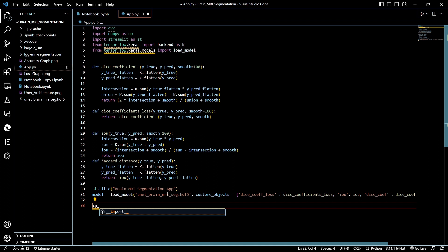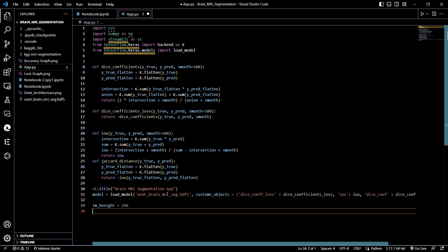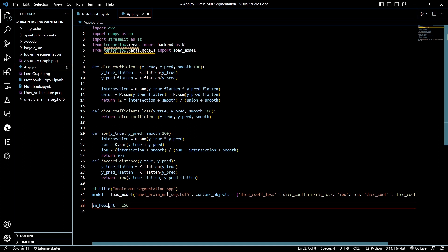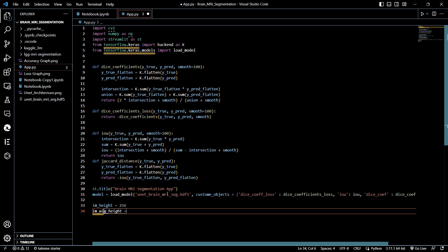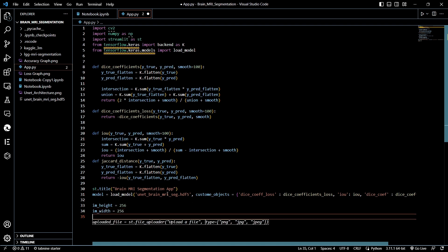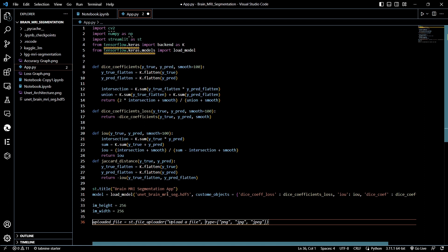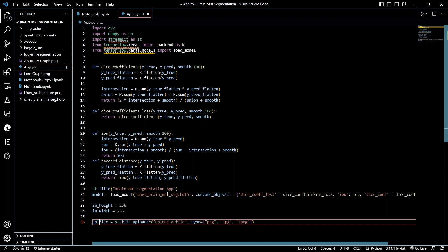Now let's set image_height to 256, as we discussed earlier, and image_width also to 256. Next, we define the uploaded file variable — we'll just name it 'file' — and set it equal to st.file_uploader().